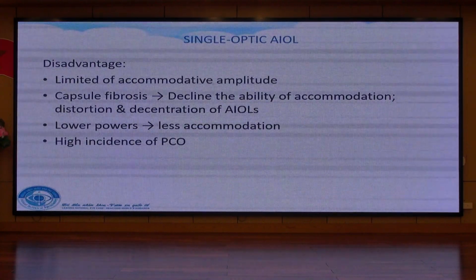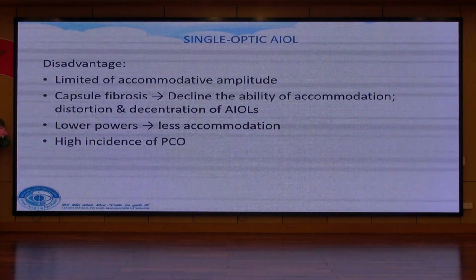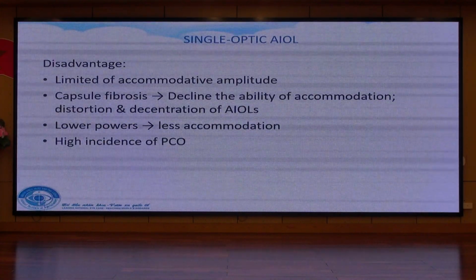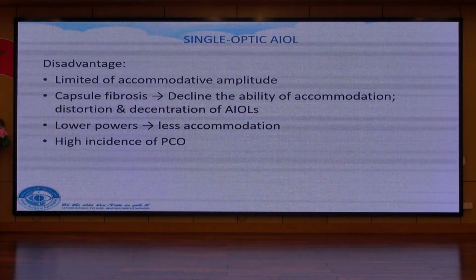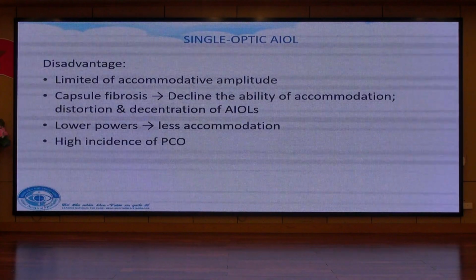Also, single optic AIOLs have some limit of accommodative amplitude, and there is capsular fibrosis, which causes decline in the ability of accommodation and distortion of the IOLs.